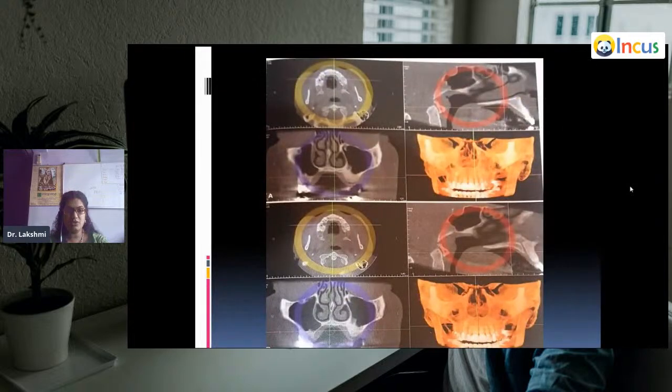See this image. Here on the right there are axial, coronal, and sagittal images. When you come to B, all the other structures which are supposed to be in the anatomic part, that is the area of interest or the field of view, are put together over here.